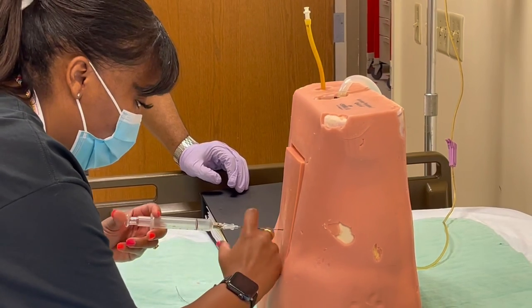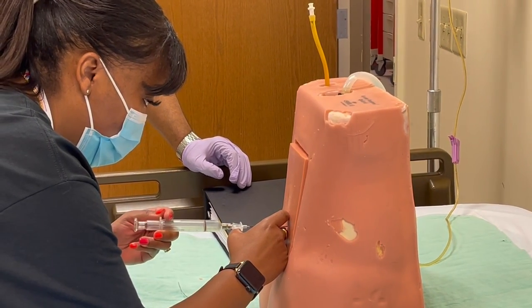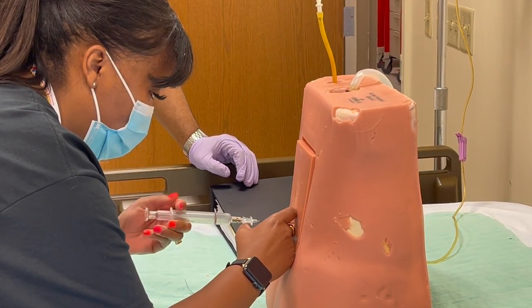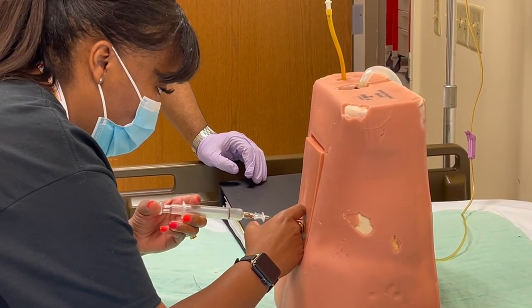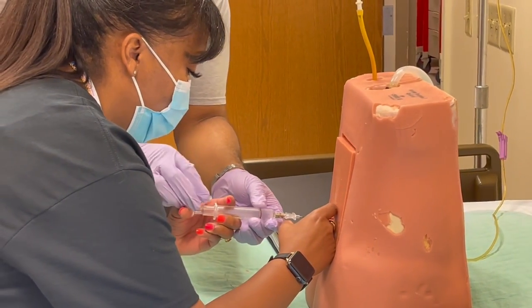Okay, perfect. So tap, tap, go forward. Small movement going in. You can be a little aggressive with the tap-taps just to see. I don't feel much more. You lost resistance? Yes — I mean, I'm too far. I don't know. I'm too far.